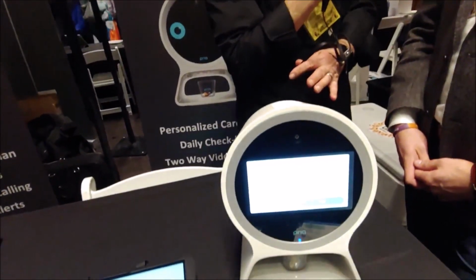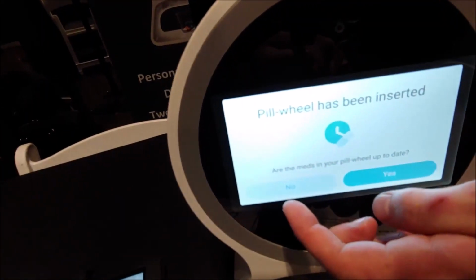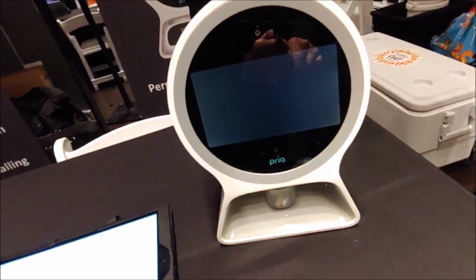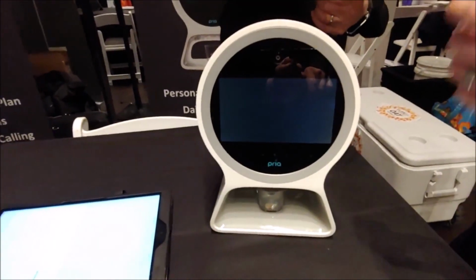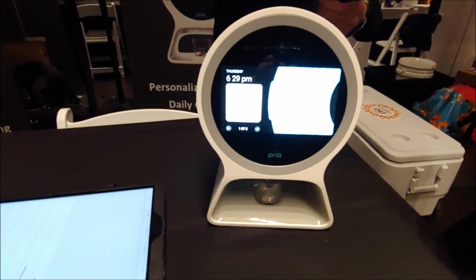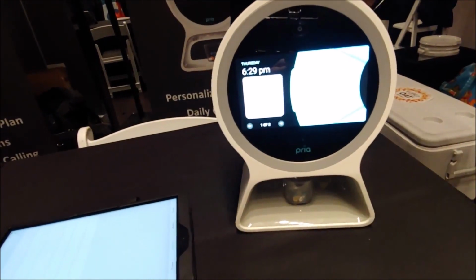And so she goes up to it, and does she do anything? Do the pills come out a slot? Yep. So all she needs to do is stand in front of the device. And if she uses facial recognition, it will recognize her. If she doesn't want to use that, she can type in a 4-digit PIN code. And from there, she can actually have the meds be dispensed, which will go into this cup. And it will show her on the screen what meds were supposed to come out, how many, what they look like, and a little more context around maybe, hey, make sure you drink water with this dose.